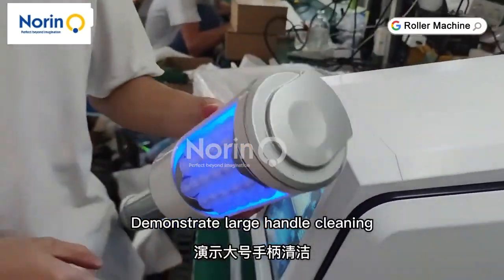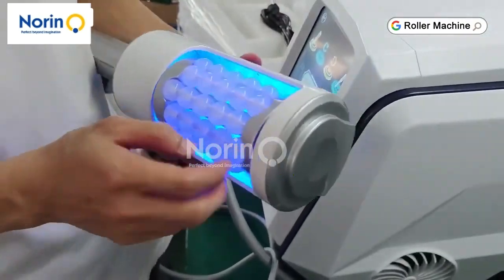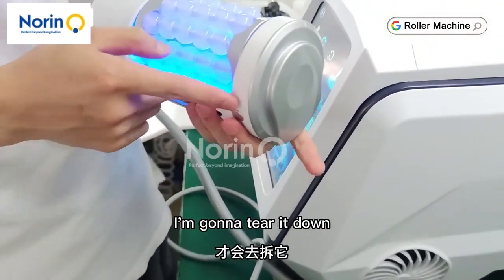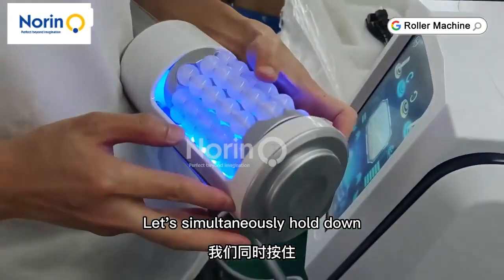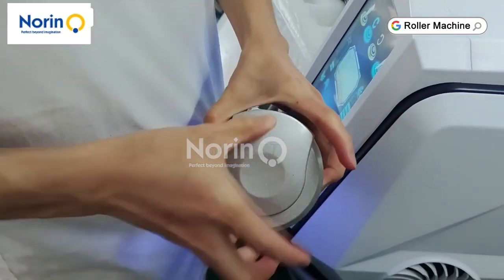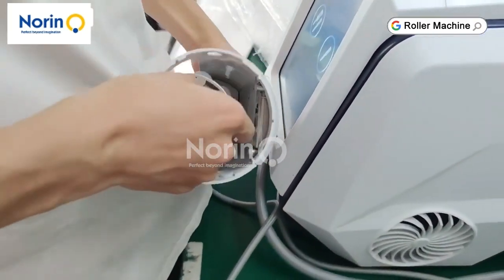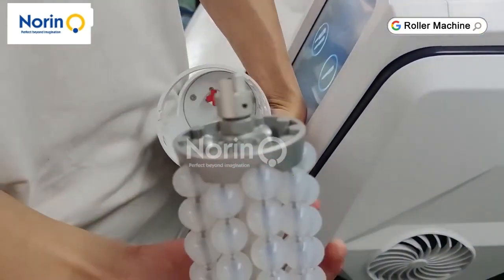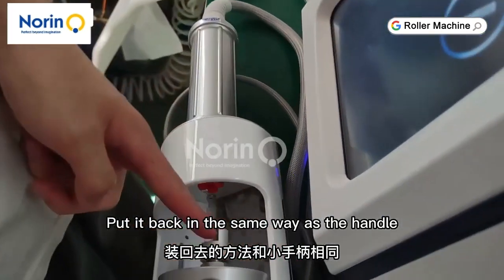Demonstrate large handle cleaning. Use the same saline solution — just wipe the surface. If it's really dirty inside, it is necessary to disassemble and clean. Press the button on each side simultaneously and hold down to pull out the top cover. Pull out the roller. Clean the inside and the roller. Put it back in the same way as the small handle.